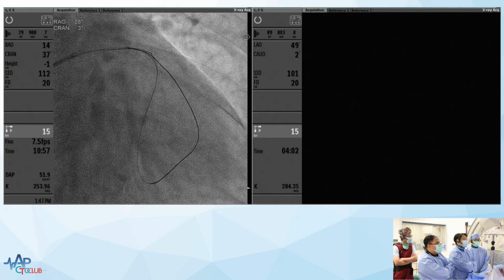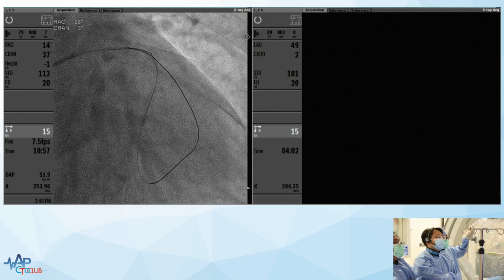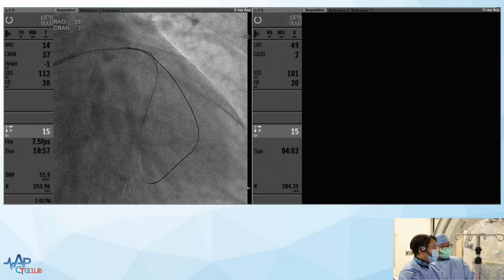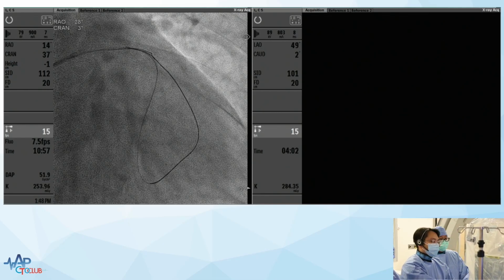Okay. So we totally agree that, because the septal channel is quite small, we don't want to rupture the channel. The problem is that if we want to advance the microcatheter, there is some resistance in the bend. As I mentioned before, I need some force. So if we try to use a ping pong guide, my concern is that although there is protection with the microcatheter, there is still some chance of injuring the septal channel.